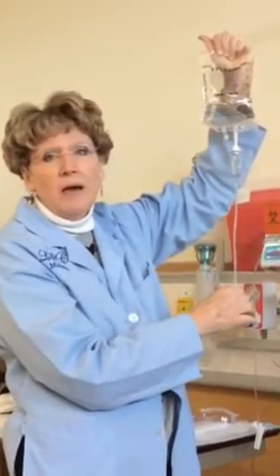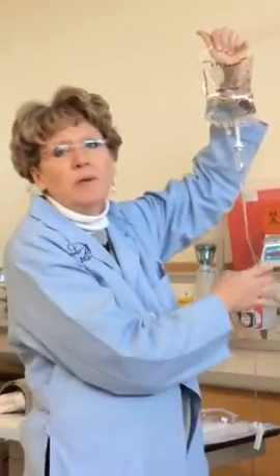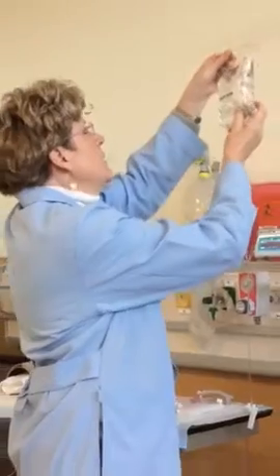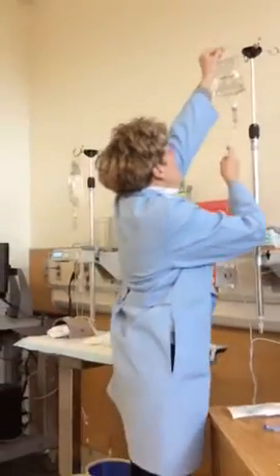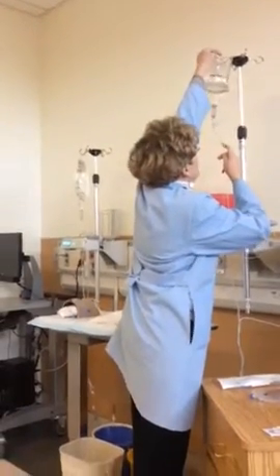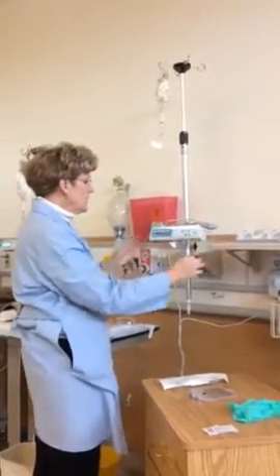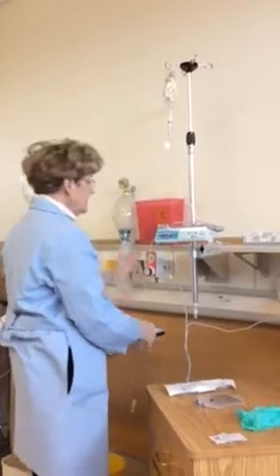And then when we come back, once the IV piggyback has run in, we're going to need to discontinue this line and flush their intermittent device. So we've got our saline bag at 0.9% sodium chloride. It's in the pump, so I need to get my pump set first and get this running.